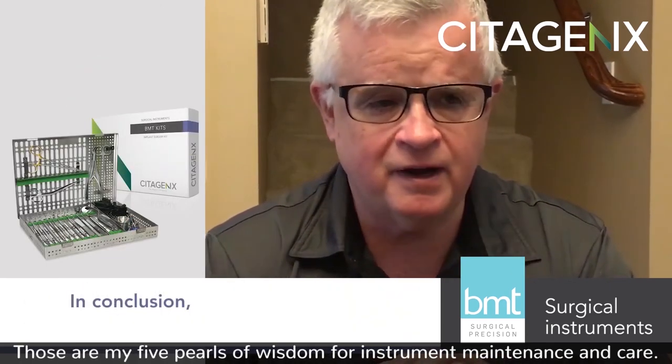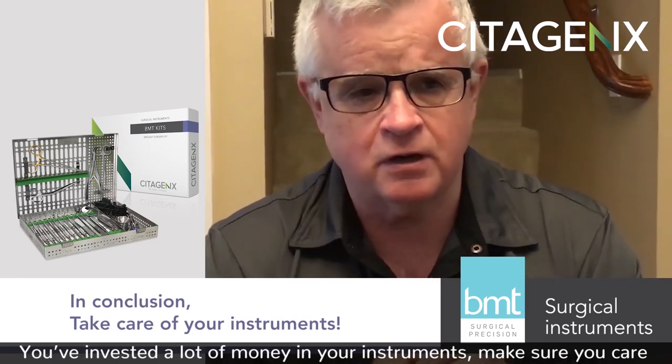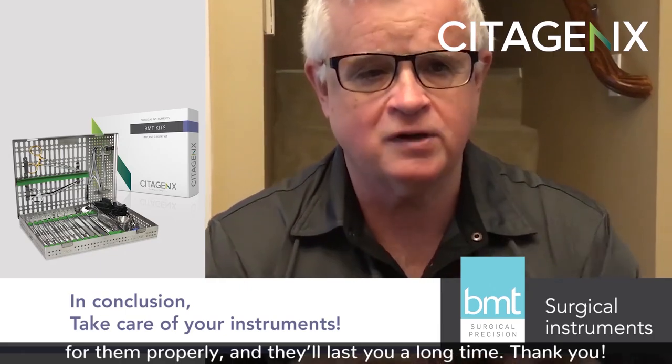So those are my five pearls of wisdom for instrument maintenance and care. You've invested a lot of money in your instruments — make sure you care for them properly and they'll last you a long time. Thank you.